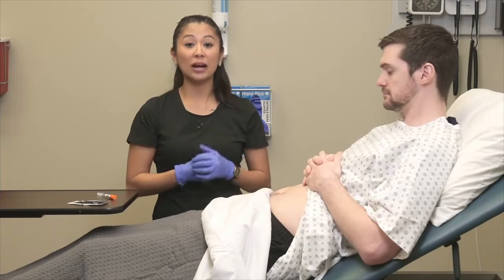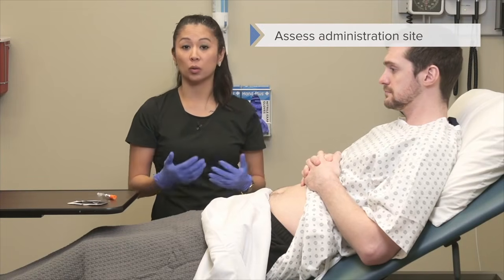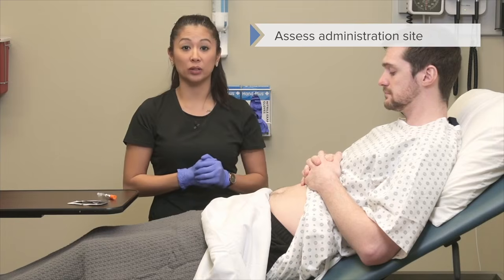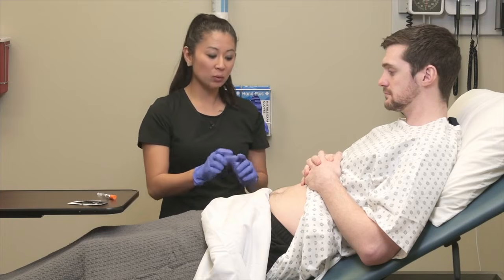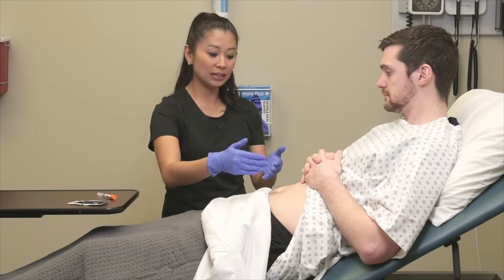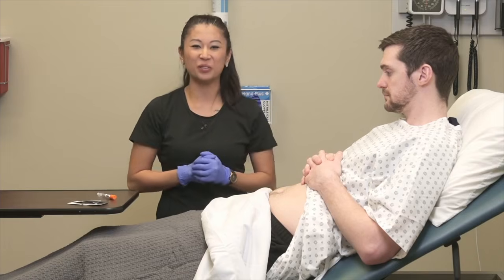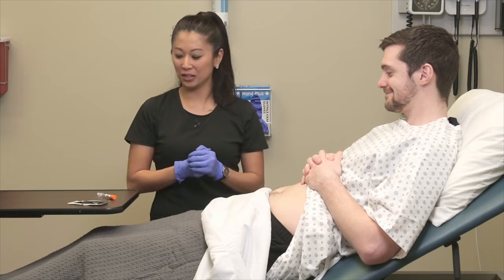So before I give the injection, I want to assess the site, make sure there's no wounds or scars on the place that I'm going to inject. Typically we want to go at least about an inch out from the belly button, and anywhere here on the abdomen we can go all the way to the love handles, if you will, on the side of the stomach.